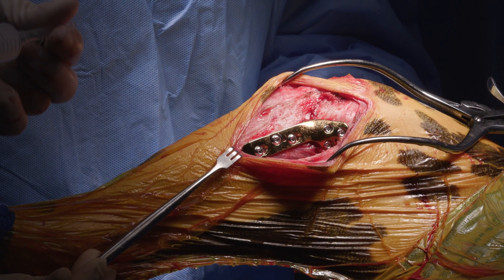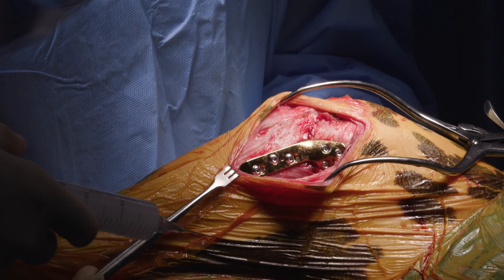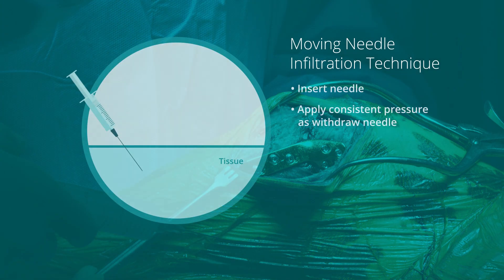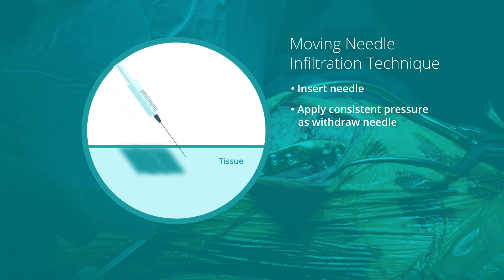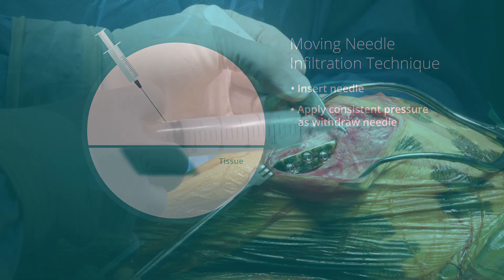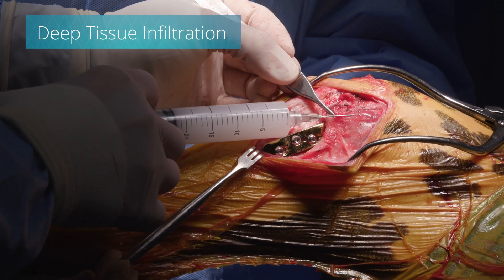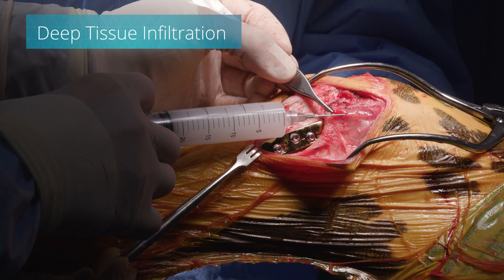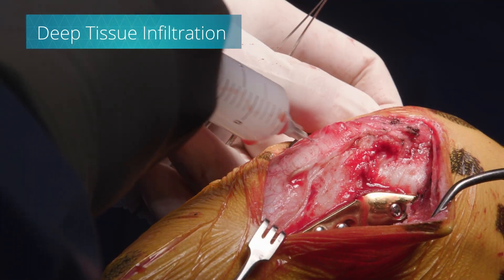The joint and proximal tibia have been approached from a medial aspect and we're ready to close the tissue. First, the joint capsule should be closed carefully. The key is to inject an appropriate amount in every tissue layer affected by surgery. To infiltrate the tissues properly, we'll be using a moving needle infiltration technique. Inject Nesita into the deep tissue layers around the joint capsule and the surrounding muscle and fascia. Be sure to infiltrate caudal to and lateral to the tibia.